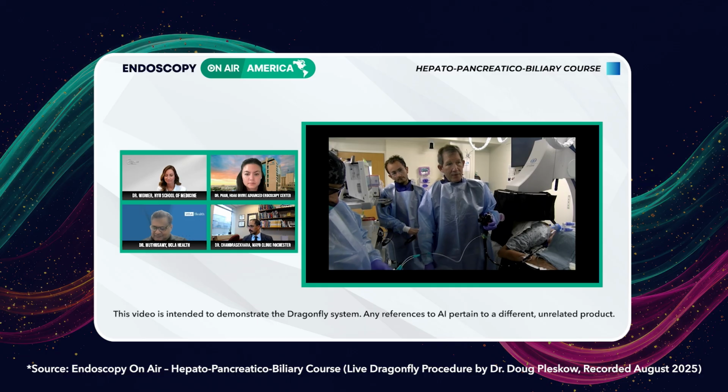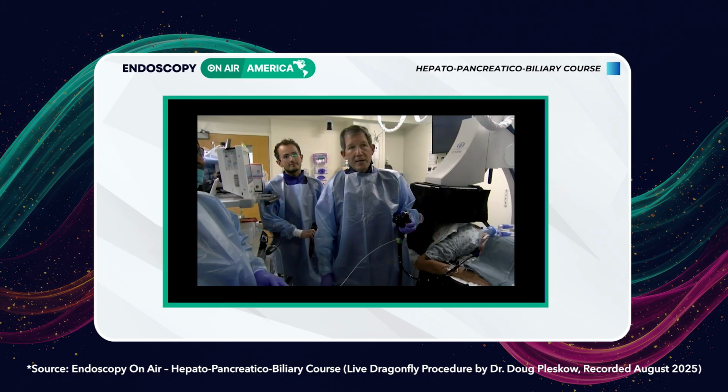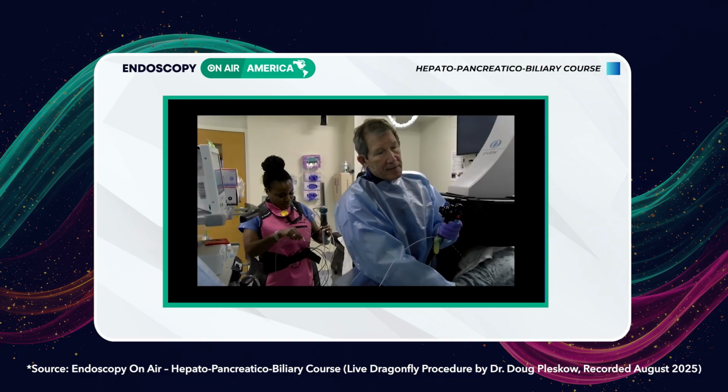Right. Thank you, and welcome back to Beth Israel Deaconess Medical Center. In the room, I have Kasim, who is one of our advanced endoscopy fellows, and Dr. Boston is my partner in crime here as well. So let's get to the case.